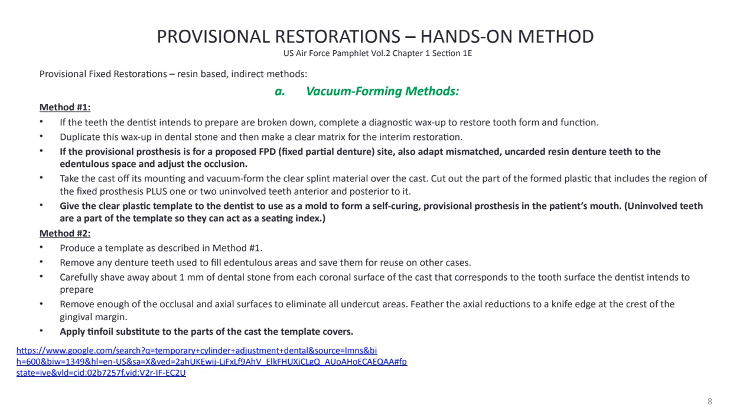clear plastic sheets, more like the Invisalign or the clear aligner type of plastic. In this method we're using what's called a vacuum forming unit that has a little platform where the plastic sheet is held in place and warmed up, and then once it's warm, under the vacuum pressure, it's pushed over the model, and it takes the shape of the model.